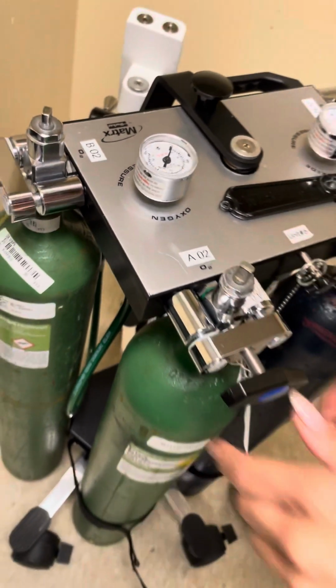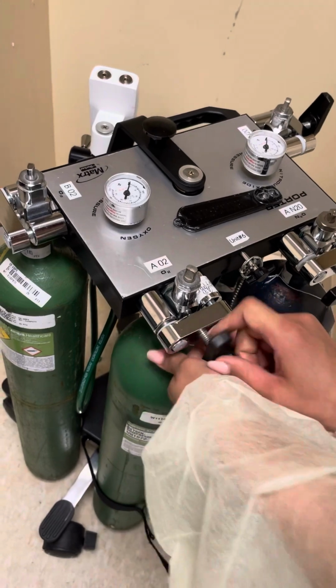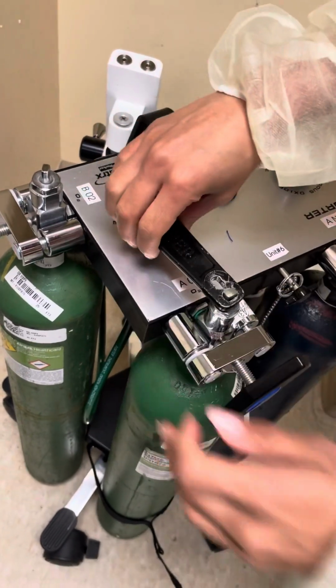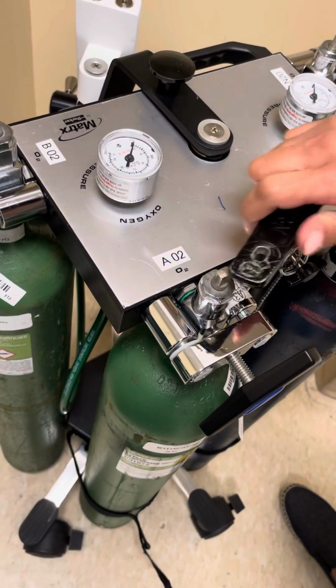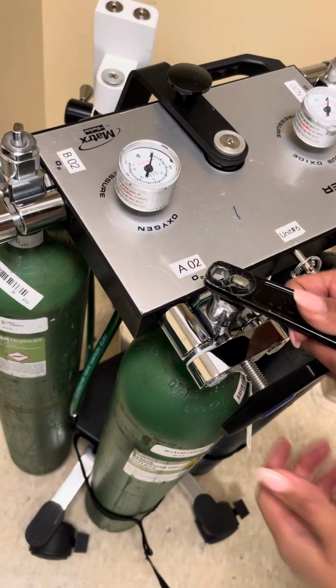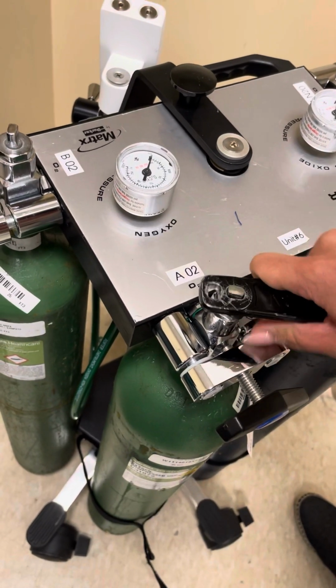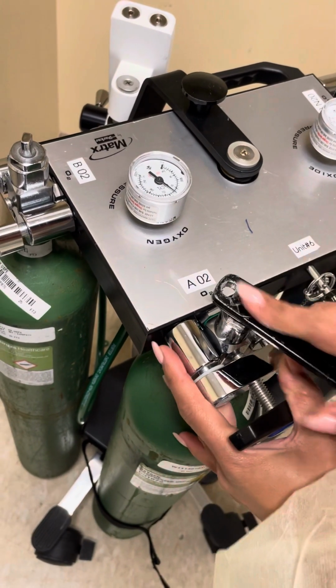Okay, so if the tank was not screwed in tight enough, you would hear a noise like this. Okay, that means that you did not screw this lever tight enough. So just screw a little bit tighter, and then you won't hear the hissing anymore.